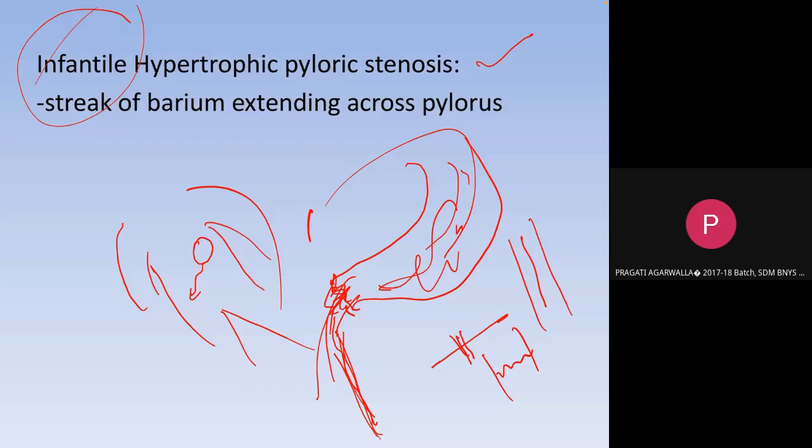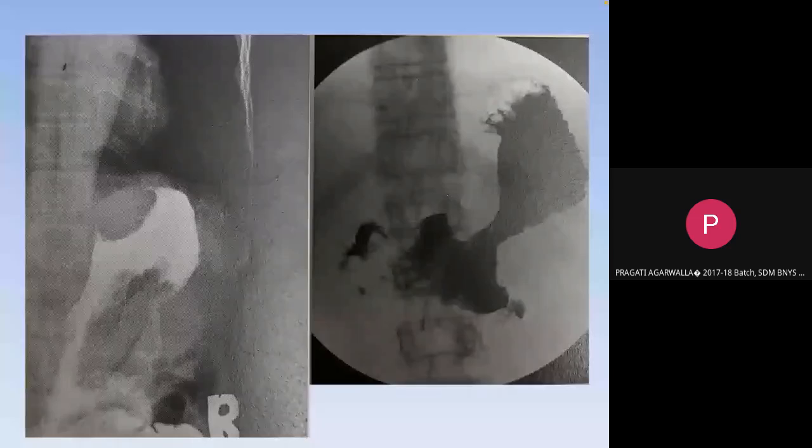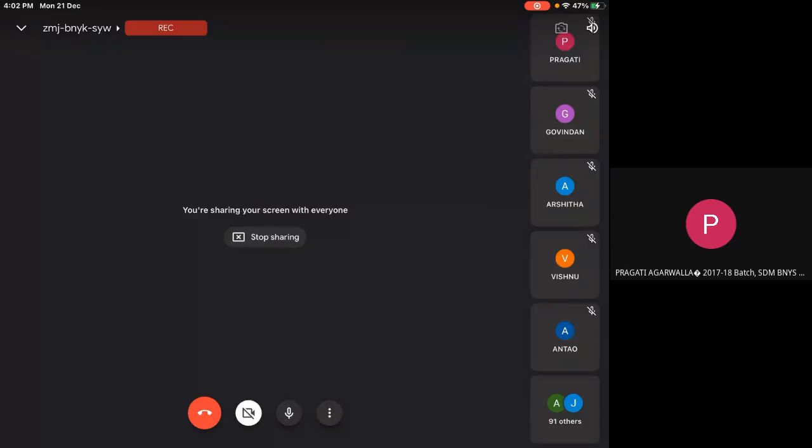And this is the image. Okay, this is your turn now. What could this be? Look at the stomach. What could this be? Dirty or clean? Come on. Any mass? Yeah, it's a mass, exactly. This could be a mass.